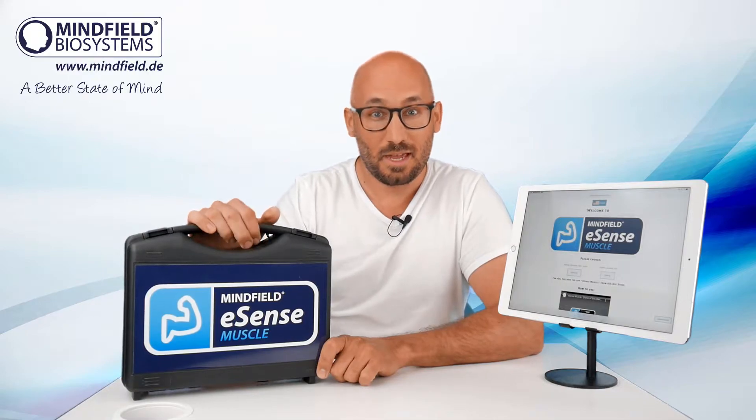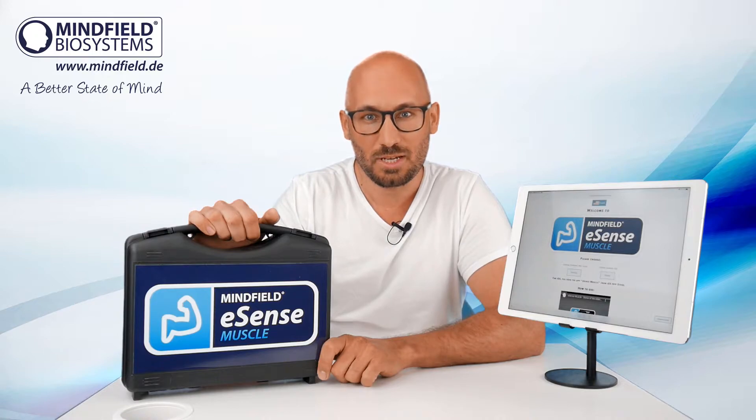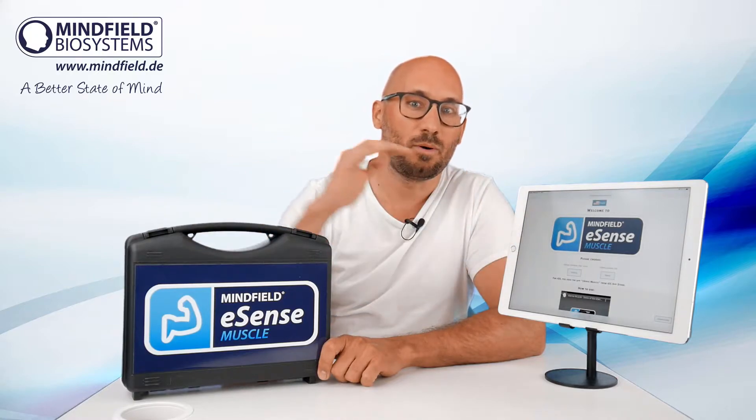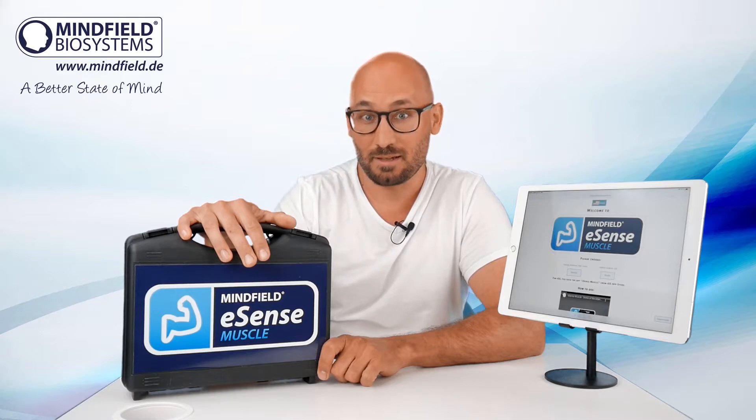This is a new innovative, modern, precise two-channel EMG biofeedback device. It comes in this little box and a new web application that allows you to do a lot of different training.